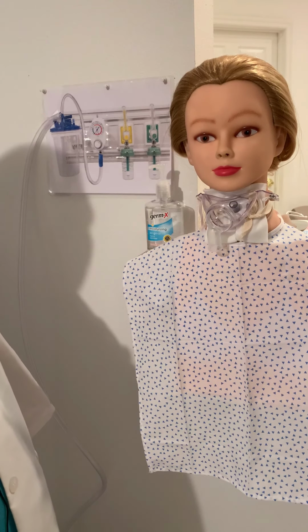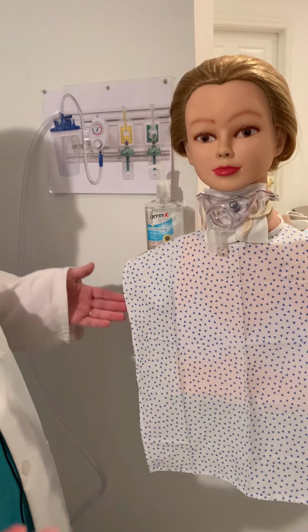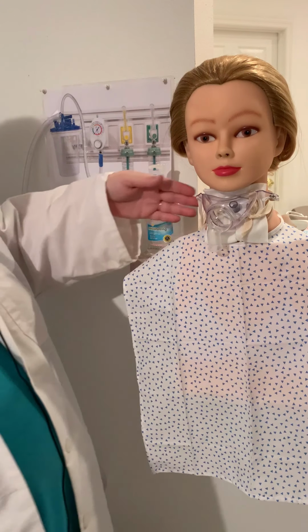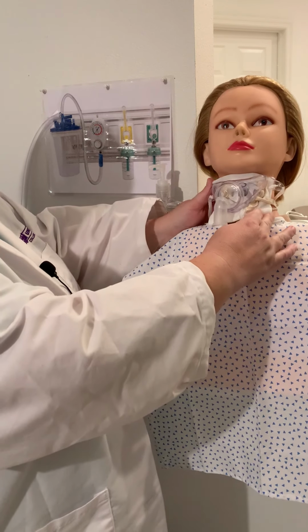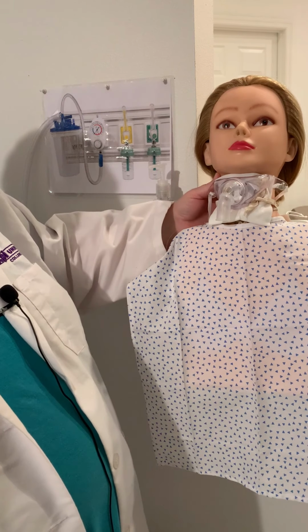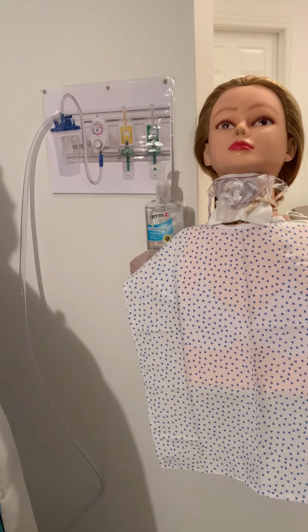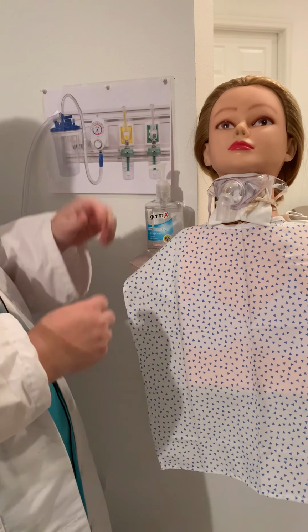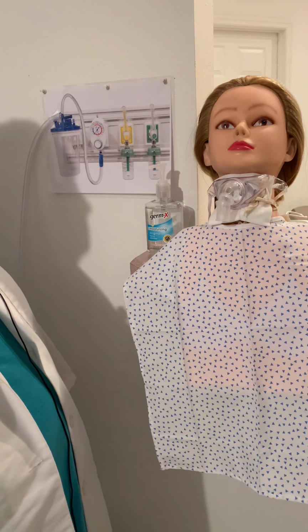So next I want to get my patient in position. So I'm going to elevate the bed a little bit so it's a good working height. I'm going to put the patient in Fowler's position. This is as close to Fowler's as this one goes. So Fowler's position. And then I'm going to make sure the side rail is down on my side of the bed. Make sure it's up on the opposite side of the bed.